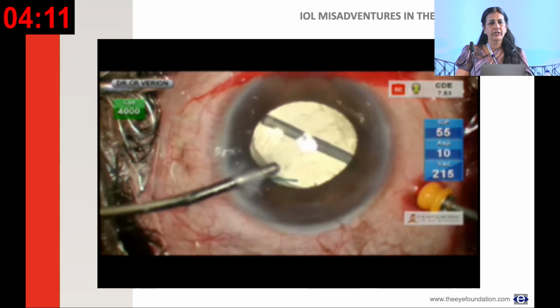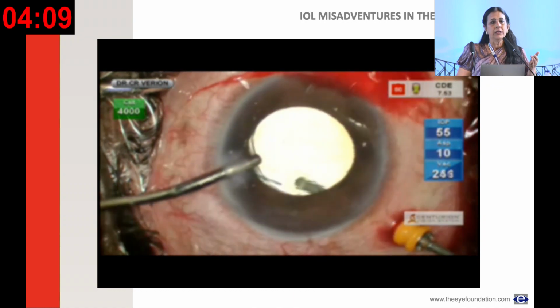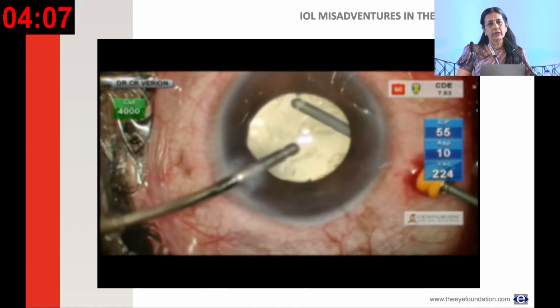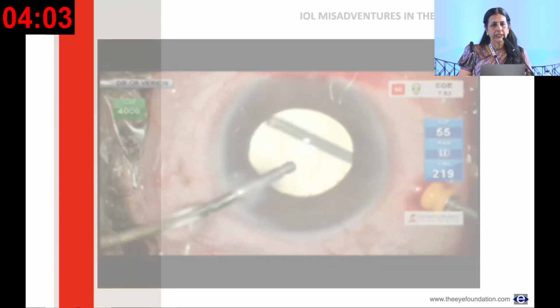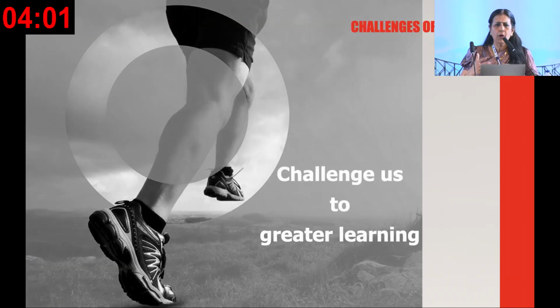Even if you are a good anterior vitrectomy surgeon, you are not a pars plana surgeon, you could take the help of your retina person, and probably this would be the best way you could deal with in this moment. So probably the challenges of the moment teach us greater and greater learning, and this was my effort to share these few videos with you all, to just tell you the various situations where you could deal with your PCRs.